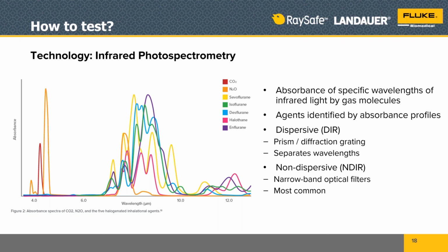And you can see that these wavelengths are really bunched together. So these sensors are really sensitive, to be able to filter out which agent is truly being administered. If you think about that, these are highly sensitive products that deserve highly sensitive testing. So it's good to know how these things operate and how specific they really are.